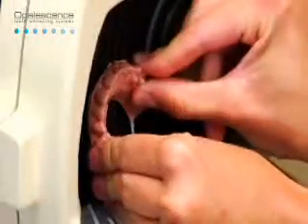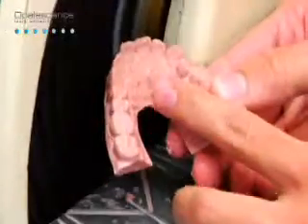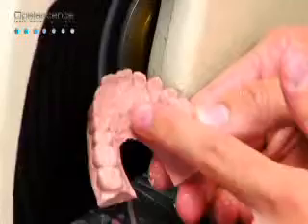Trim the base of the cast parallel to the occlusal table plane on a model trimmer to within a few millimeters of the gingival margin for ease of manipulation. Note that the palate and tongue areas are removed.